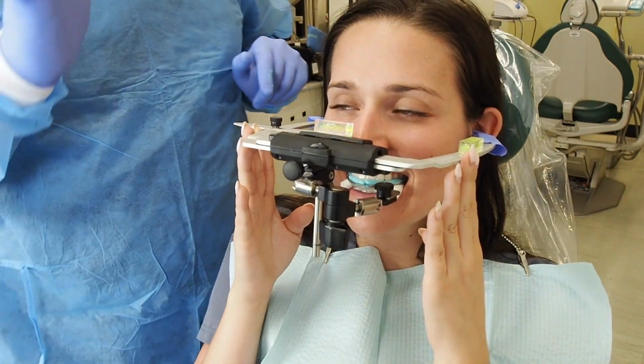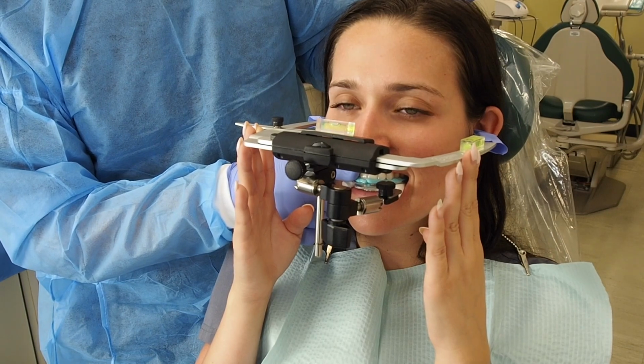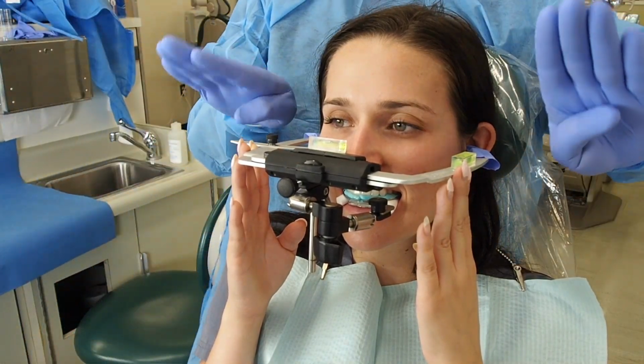And now I have the position of the maxillary, right? The distance between the maxillary teeth to the axis of rotation of the mandible.